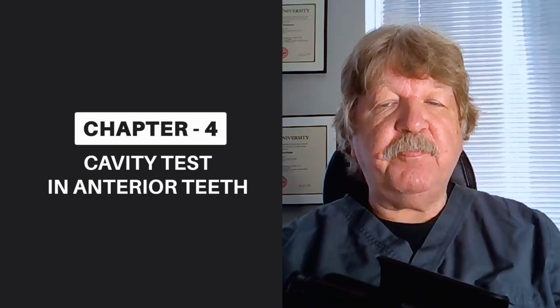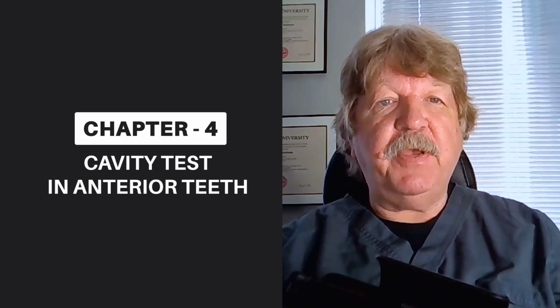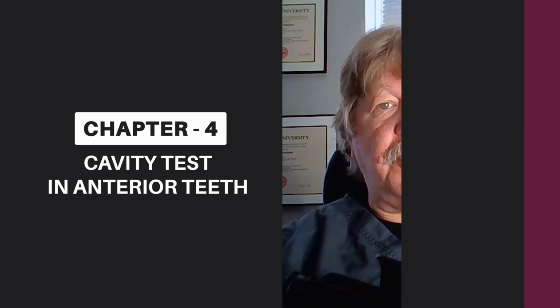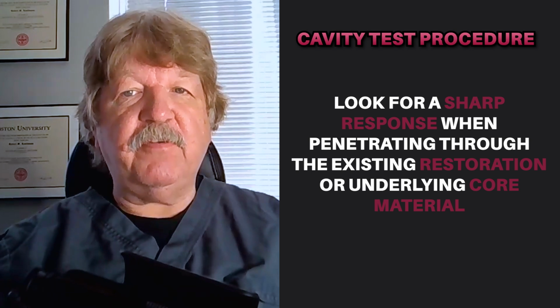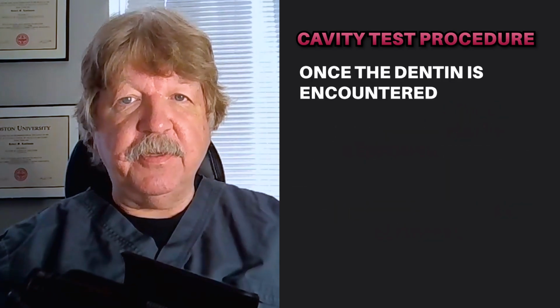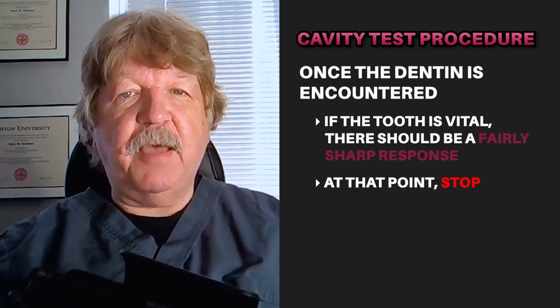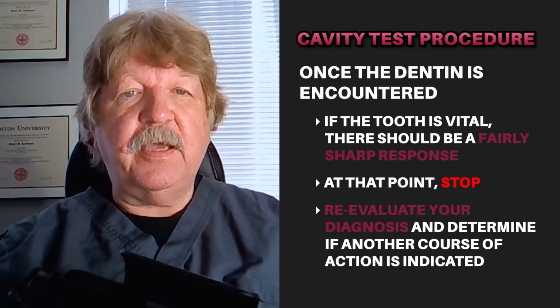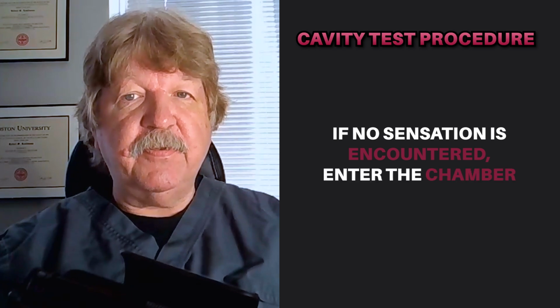In the case of crowns, penetration into the metal of the crown occasionally causes the burr to chatter a bit, and the patient should be forewarned that this is normal. What we're looking for is a sharp response when we penetrate through the existing restoration or underlying core material. Once the dentin is encountered, if the tooth is vital, there should be a fairly sharp response. At that point, stop. Reevaluate your diagnosis and determine whether another course of action is indicated. If no sensation is encountered, enter the chamber.